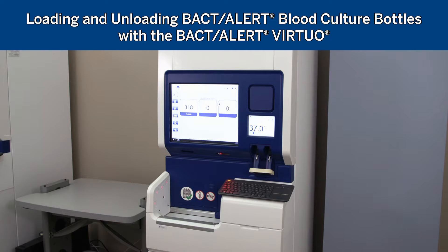The purpose of this video is to demonstrate workflow best practices for proper loading and unloading of the BactiAlert Virtuo system.